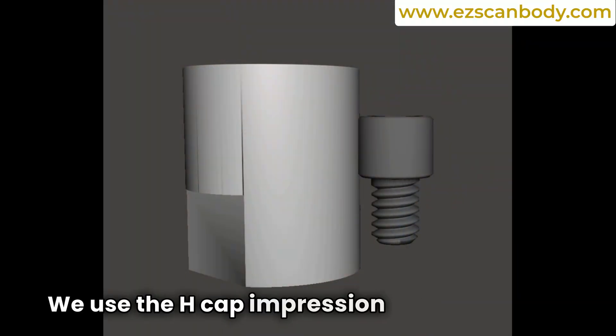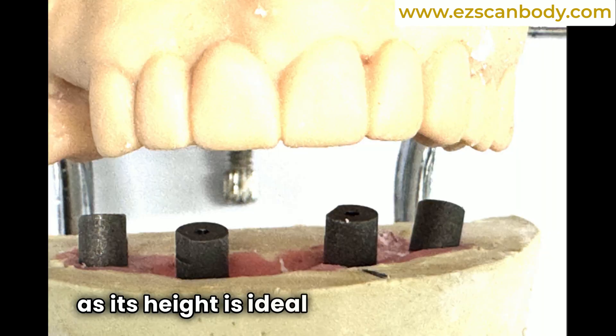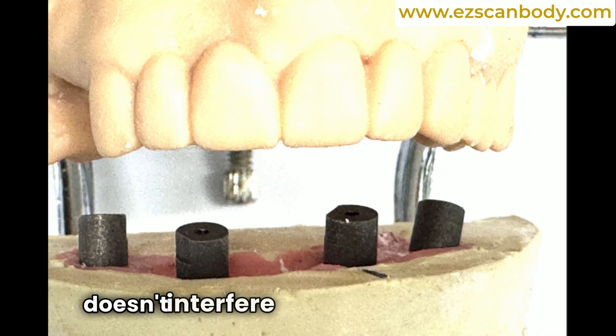We use the HCAP Impression Coping Healing Abutment from EZ ScanBody, as its height is ideal, ensuring it doesn't interfere with the bite.